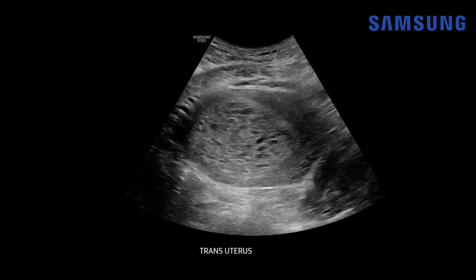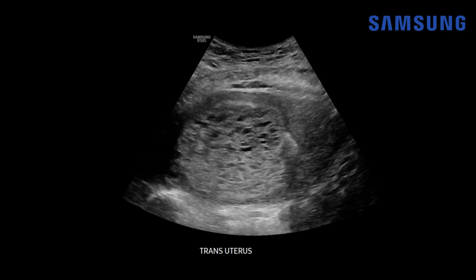We're starting here with a transabdominal image of the uterus in the transverse plane. You can see the endometrial cavity is expanded with echogenic material and it contains these small cystic spaces that are causing increased through-transmission — it's brighter posterior to this region, which is typical for ultrasound beams when they hit fluid.